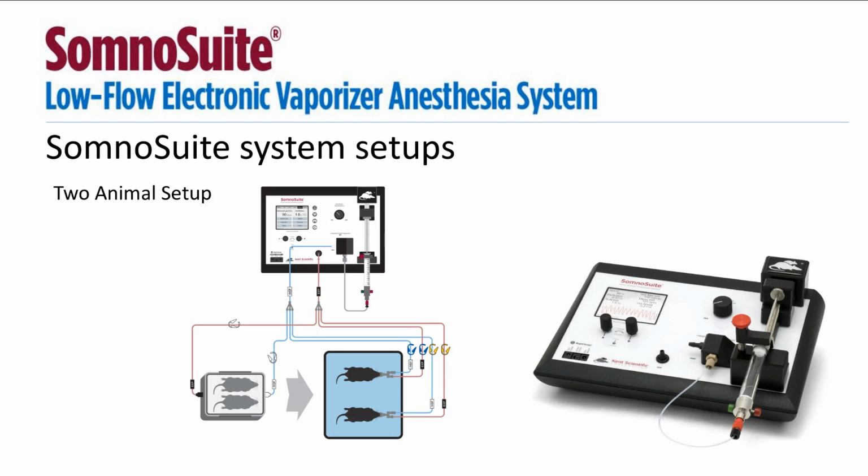In this diagram, we use a three accessory adapter. So that way you can connect your one induction chamber as well as two animals to your single setup here. Doing so will give you an additional station to work from if you plan on doing more than one mouse or more than one animal at a time.